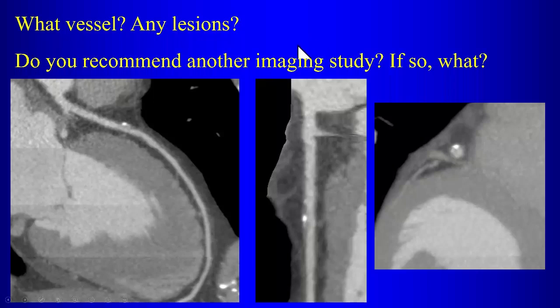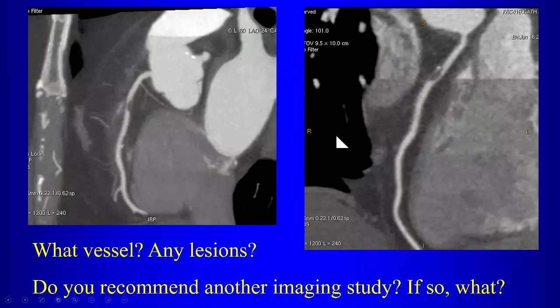70 or 30% stenosis? I mean, it's maybe 25 or so. But do we recommend another imaging study here? Yes or no? No. No, that's the point. So here you would not recommend any further follow-up, okay?